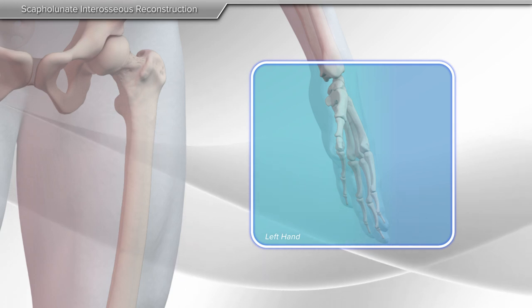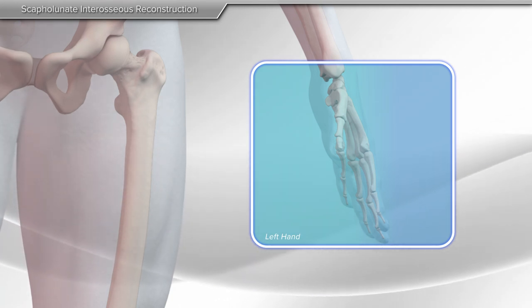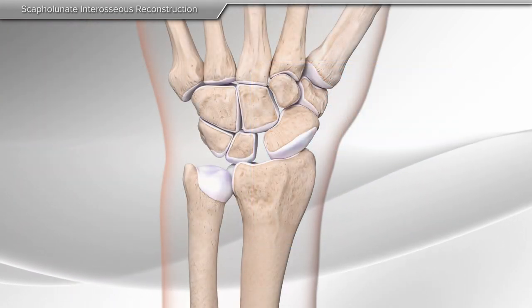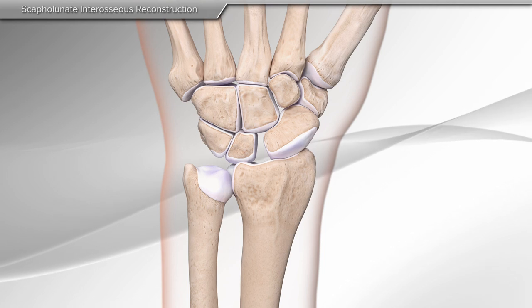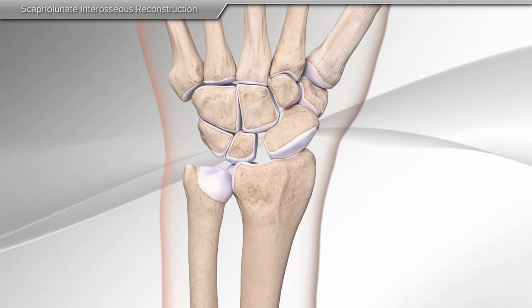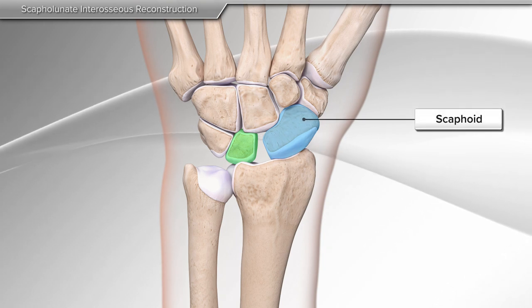In this animation, we will demonstrate the scapholunate ligament reconstruction using the internal brace ligament augmentation. The wrist consists of eight small bones connected by strong, short ligaments. The most common wrist ligament tear takes place between the scaphoid and the lunate, called the scapholunate ligament.